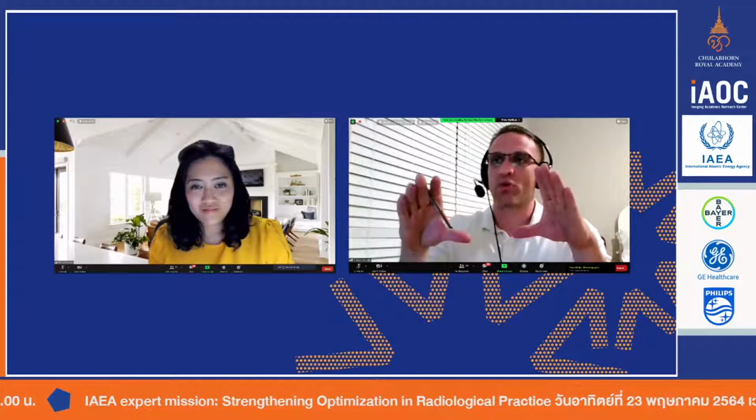They might not understand that, but what you say is, hey, we have this standard. And what we're trying to do here is make sure everyone gets the right amount of radiation for their imaging. So we make sure that these machines don't overexpose, and we're keeping the dose as low as possible. Sometimes all you have to do is say that we measure these machines, we test these machines, we're constantly making sure these machines are perfectly optimized. They don't necessarily need to know how you do it, but that sometimes makes people feel good.